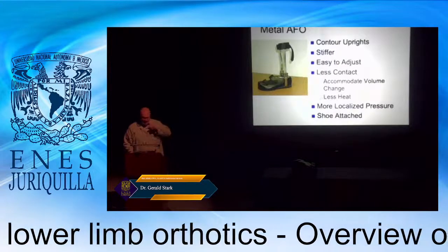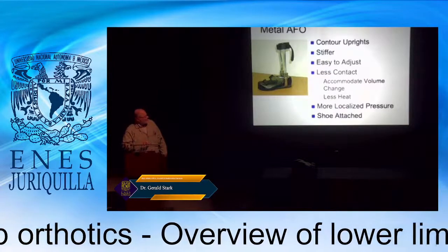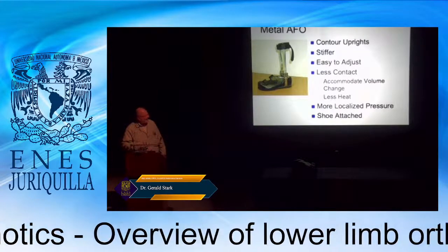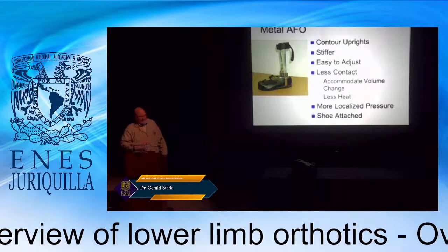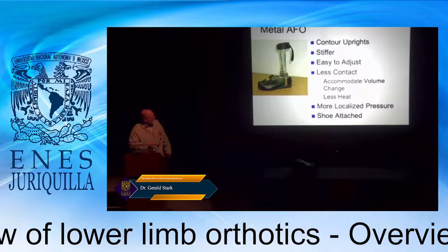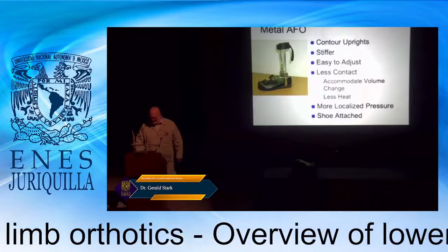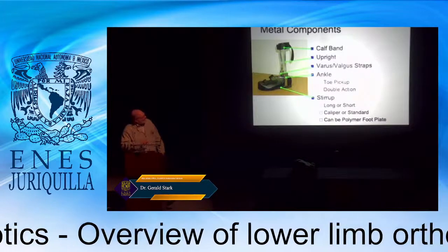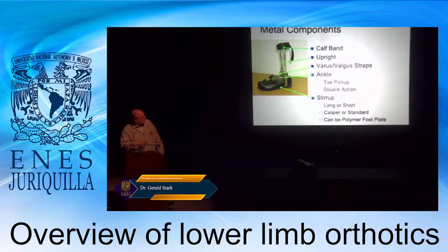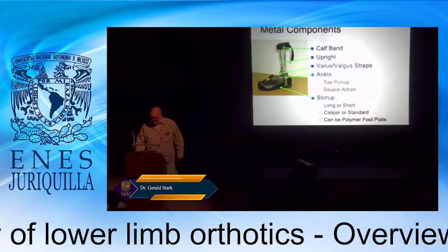So as I mentioned, metal AFO, very uncosmetic. You can still adjust it. It's not very hot at all, actually, and it can also address localized pressure. And the shoe is usually attached. So the shoe uses this stirrup on the distal section. So knowing how these things work together, the calf band, the upright, the varus or valgus straps, this is how the prescription is developed.